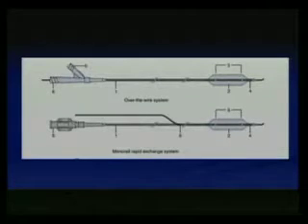So talking about over the wire and the monorail rapid exchange system balloons. So this is a balloon that goes over the wire, and this is for rapid exchange, for example, for the carotid intervention stuff. Use over monorail system and for below the knee also.